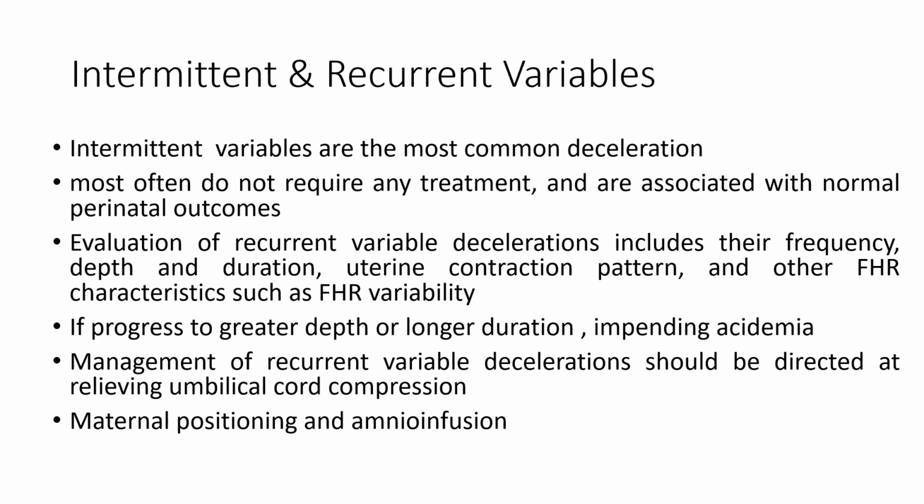So now we're going to talk about the causes and the management of different deceleration. As we said before, intermittent variables is the most common deceleration.